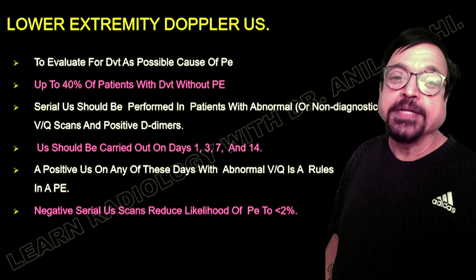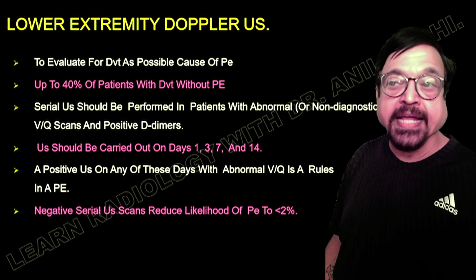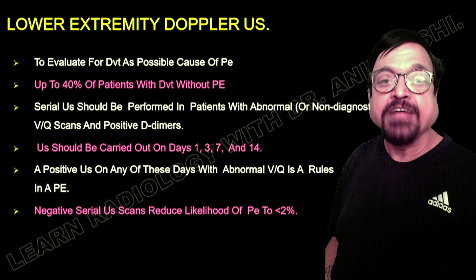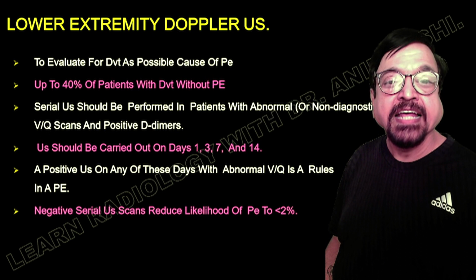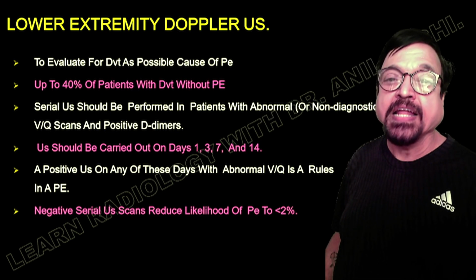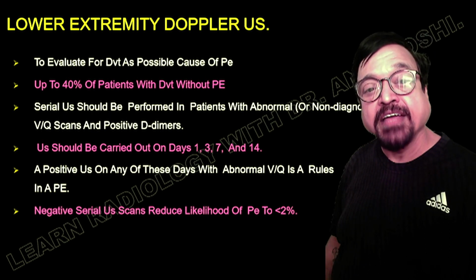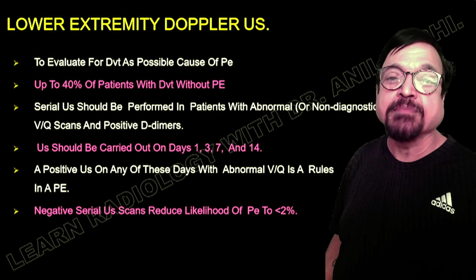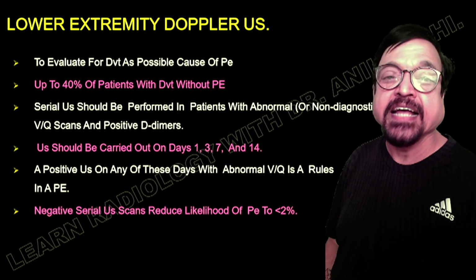Now, lower extremity Doppler is extremely important when you are suspecting or evaluating a case of pulmonary embolism. Often the scans are negative, but still a simple ultrasound test can increase the suspicion, if we subsequently find that the patient has pulmonary embolism. The symptoms are very vague, so it is sometimes really difficult to diagnose it clinically, and we have to keep these other criteria in mind.